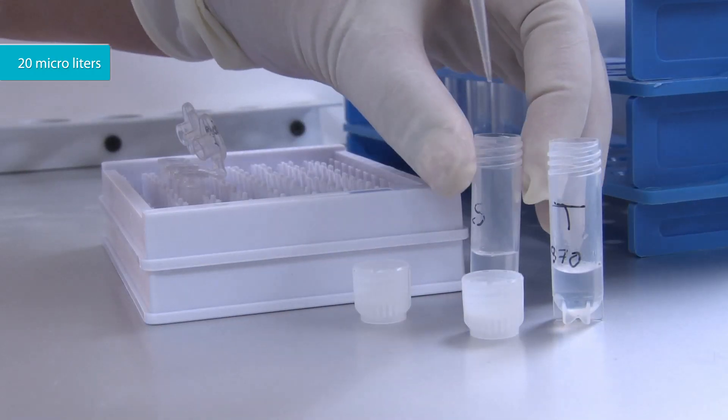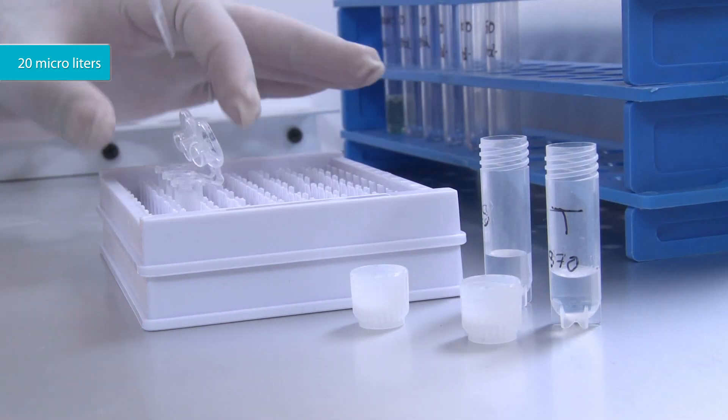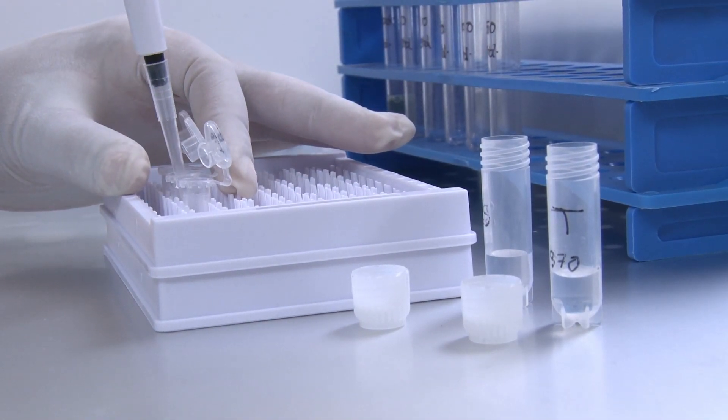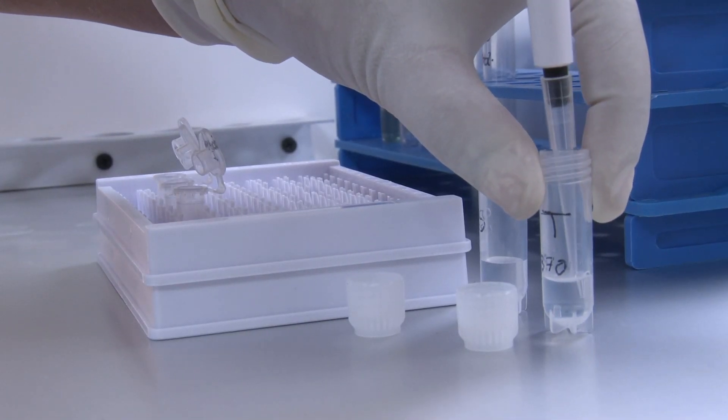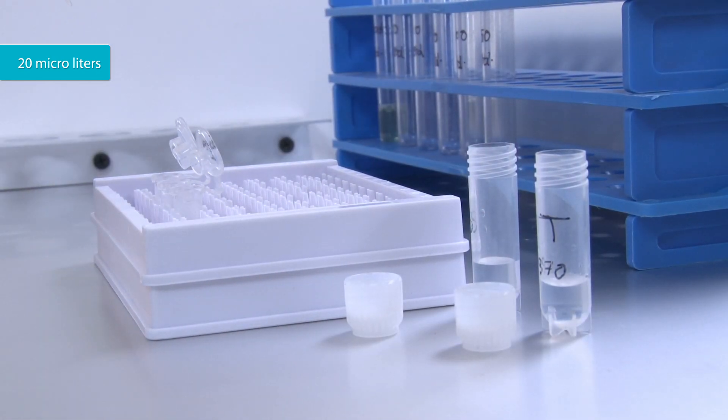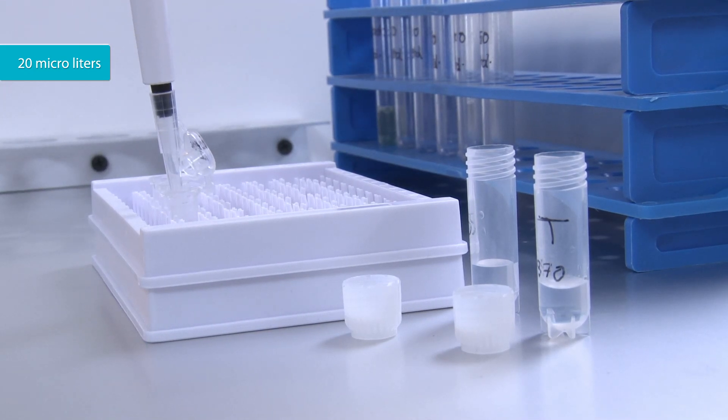Add 20 microliters of Supernatant from the Centrifuged Standard Tube to the tube labeled as Standard. Add 20 microliters of Supernatant from the Centrifuged tube labeled as Test to the tube labeled as Test.